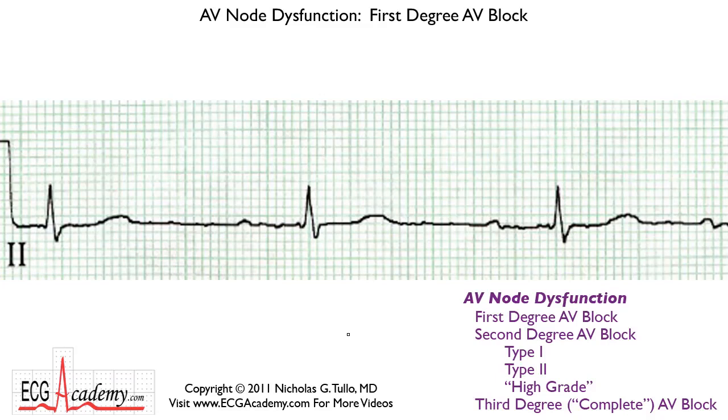And this is Dr. Nick from the ECG Academy. We're going to be continuing our discussion of the AV node and the electrocardiographic diagnosis of AV block.